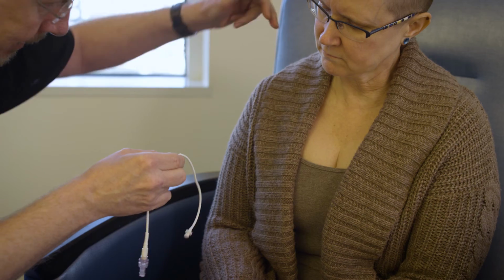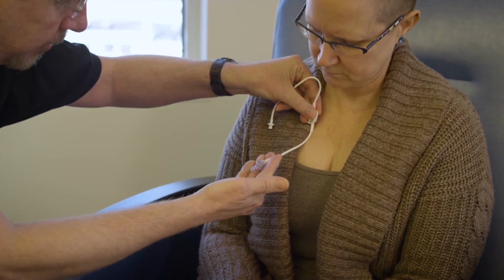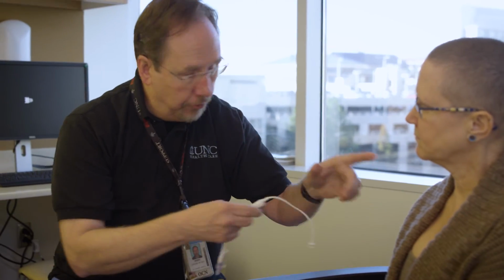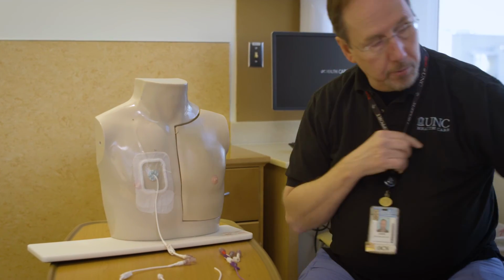And finally, there are tunneled central lines. A tunneled central line is located on the chest and is placed directly in a vein. Unlike the port, you can see a thin tube or a catheter coming out of your skin. Similar to the PICC, your care provider will include the number of lines needed for your care, as few as 1 and as many as 3.